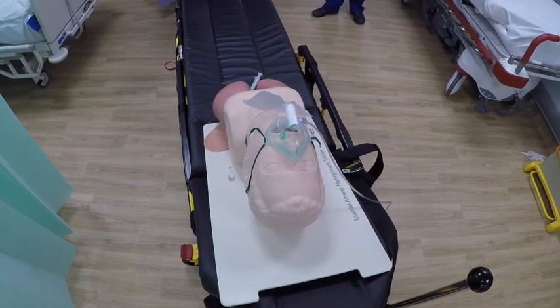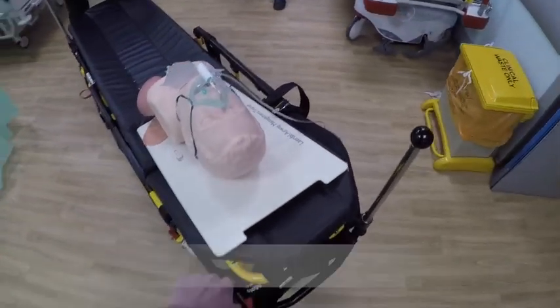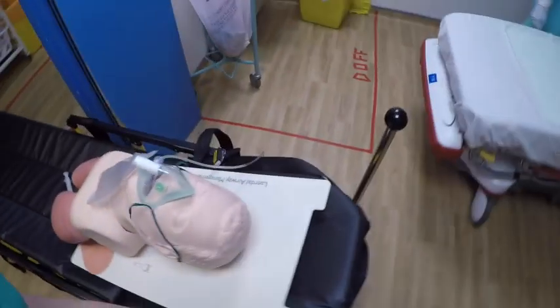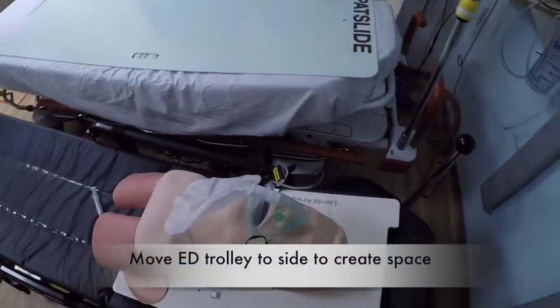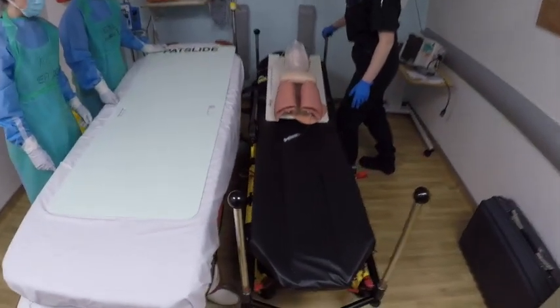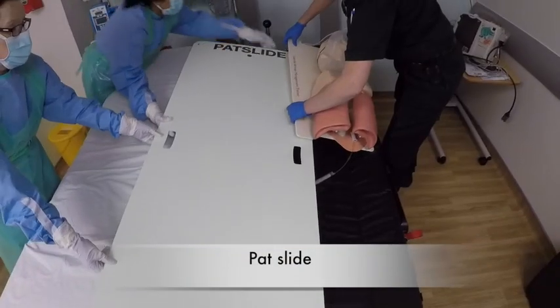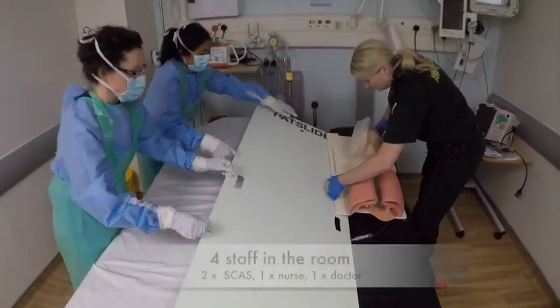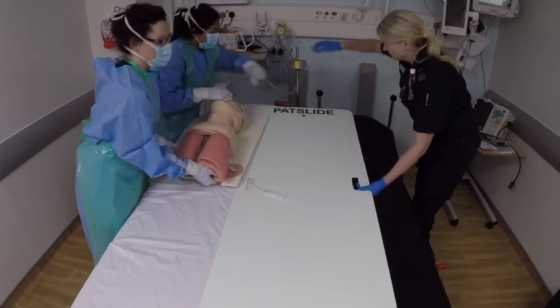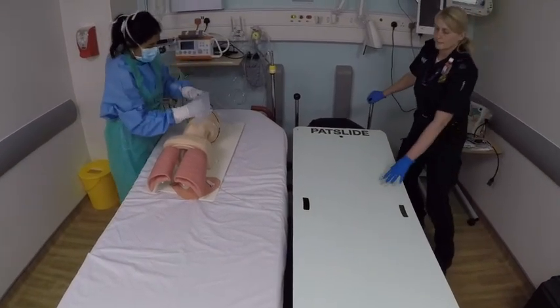As we receive the patient from SCAS, it's going to be the ED senior team leader's responsibility to make sure the patient is coming in to the respiratory ED head first. The two members of the SCAS team, who will be in their appropriate PPE, will come into the room and bring the patient up level with the trolley. Using the sheet the patient is on, they will roll and pat-slide the patient, and with the assistance of one doctor and one nurse in full PPE the patient will be transferred onto the bed. The pat slide will then be pulled out and remain in the room to be cleaned, and the SCAS team will remove their trolley to be cleaned outside the room.